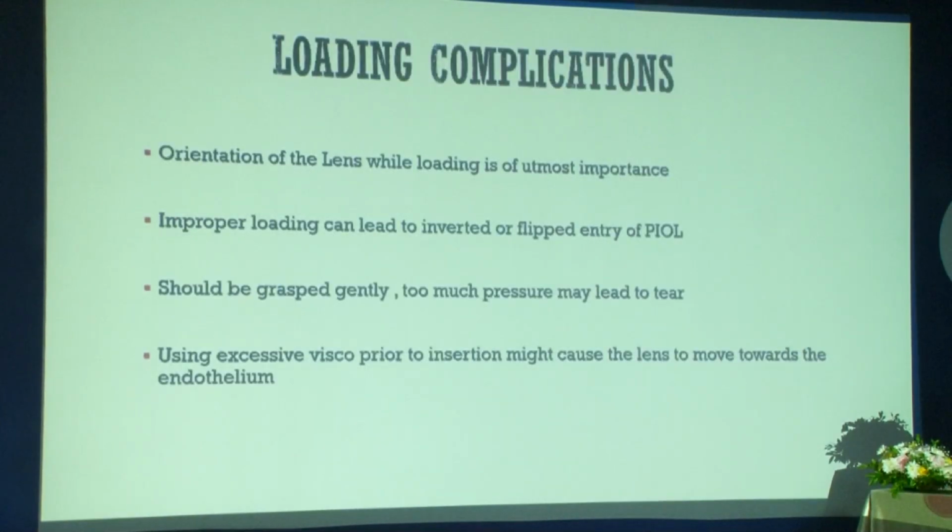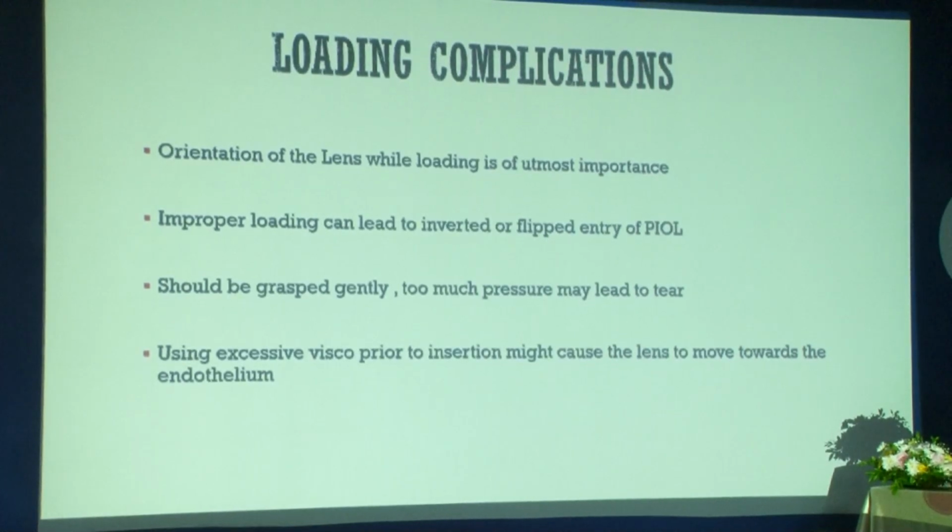The most important complication that can happen intraoperatively actually starts right from the time you load the lens. My previous speakers have made the point very clear: proper orientation, proper loading, making sure the haptics don't get caught up in the side of the injector.